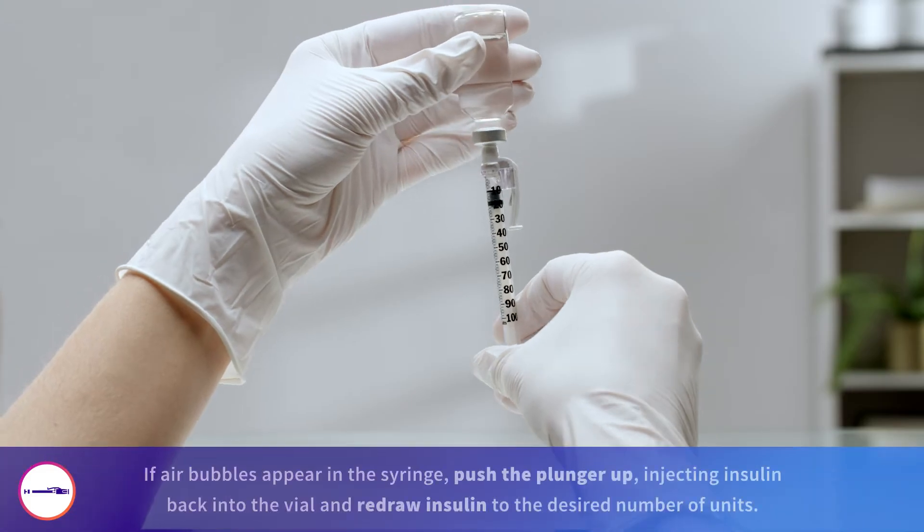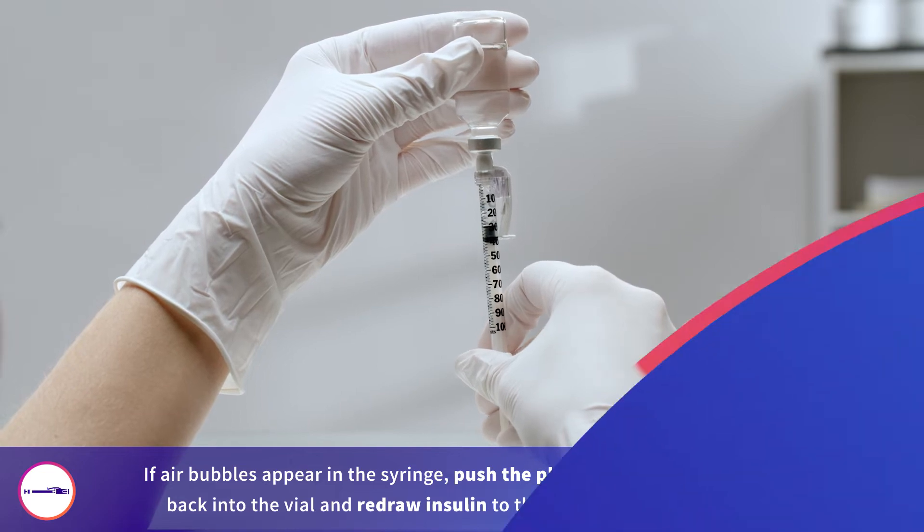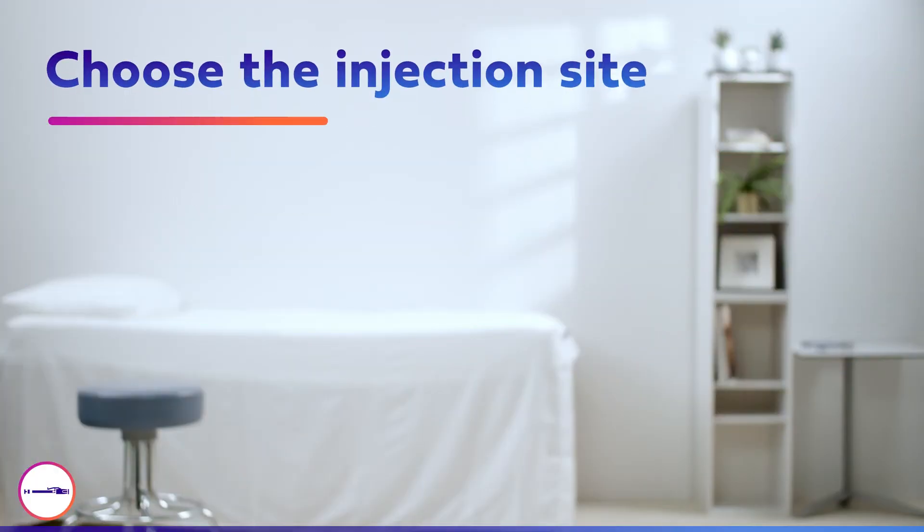Finally, draw up insulin into the syringe by pulling the plunger out to the desired unit. Next, choose an injection site.